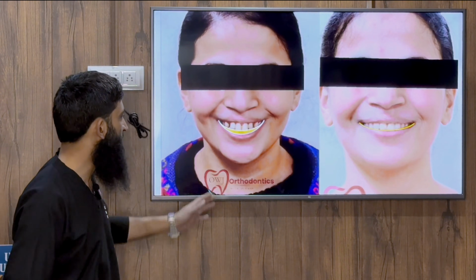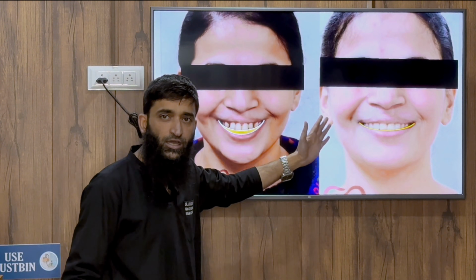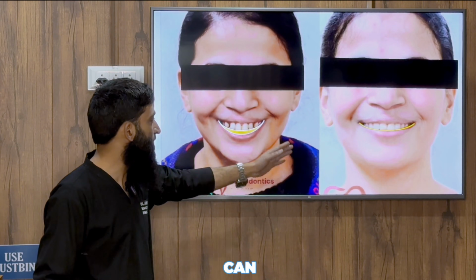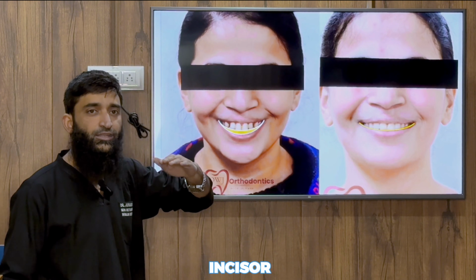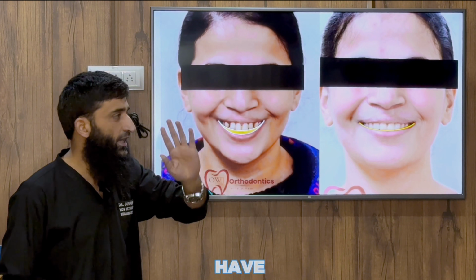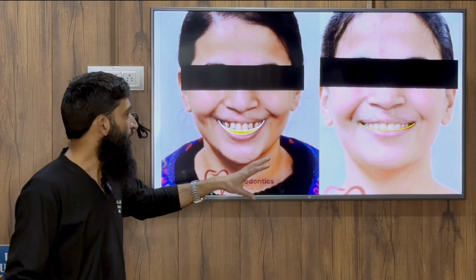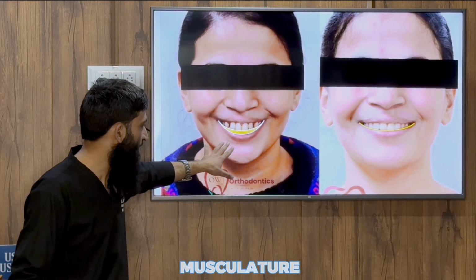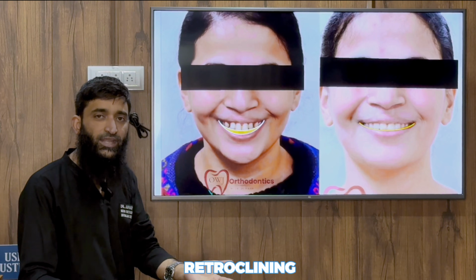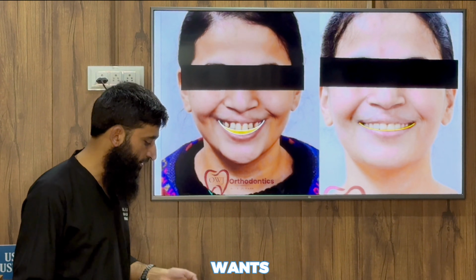This is the non-consonant smile, and now this is a consonant smile, where we can see the lower lip is touching the upper incisor tips. So this we have done in 2 ways. We have retracted the upper incisors, and we have relaxed, we have deprogrammed the musculature by retroclining the lower incisors. So this is the smile which the patient wants.